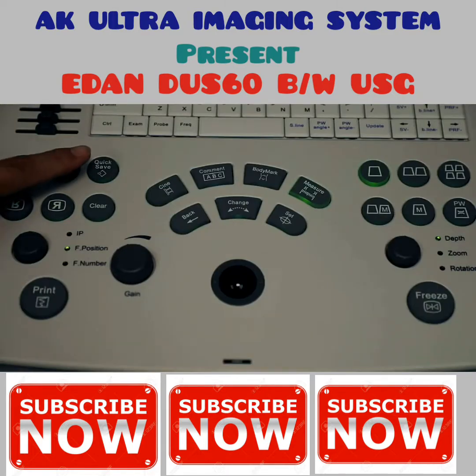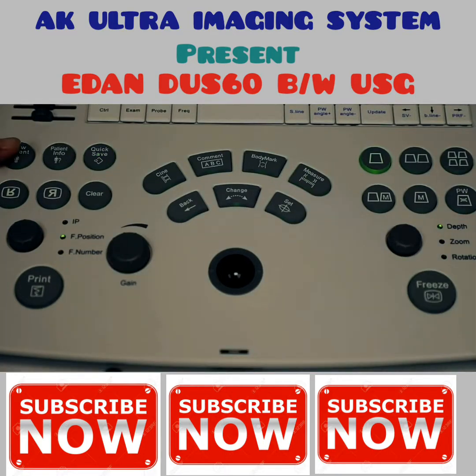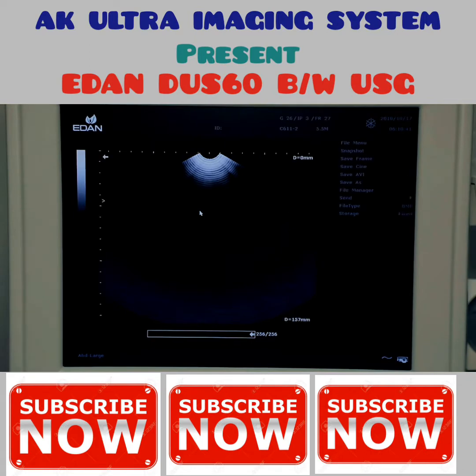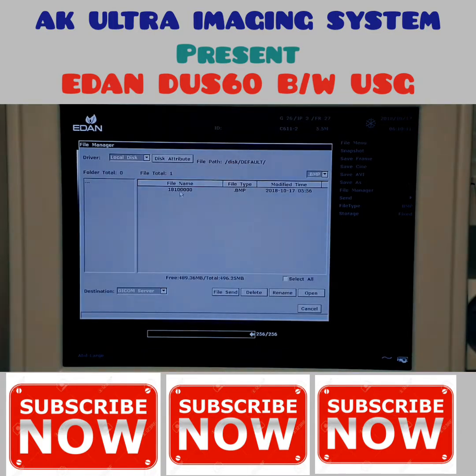To save an image, press quick save. To end the exam, press new patient. To review an image, press the file key, highlight file manager using the trackball, press set, then double click on the desired exam to review.